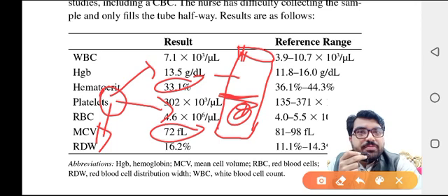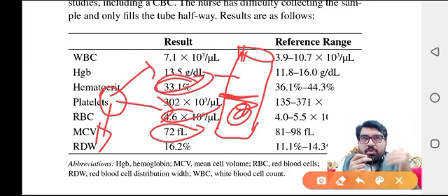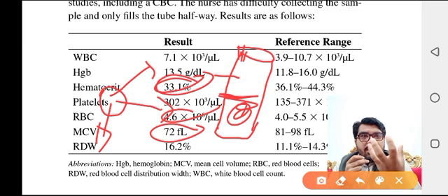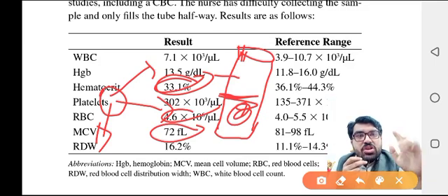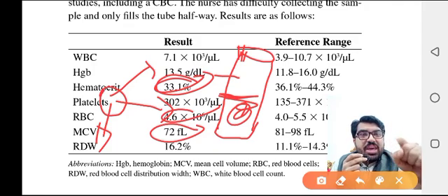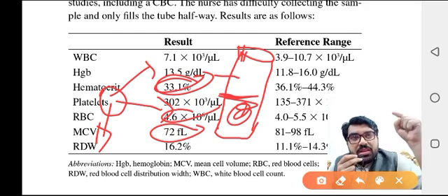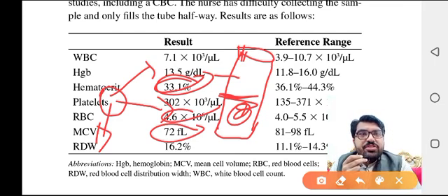The machine calculates hematocrit from MCV and RBC count. If your MCV is low, hematocrit will also be low. So: less blood → more EDTA → RBC shrinkage → low MCV → low hematocrit. This is an error, not the actual finding in the patient. As a result, you may order further studies unnecessarily. Before proceeding to further studies, you must repeat the CBC and address this collection error.